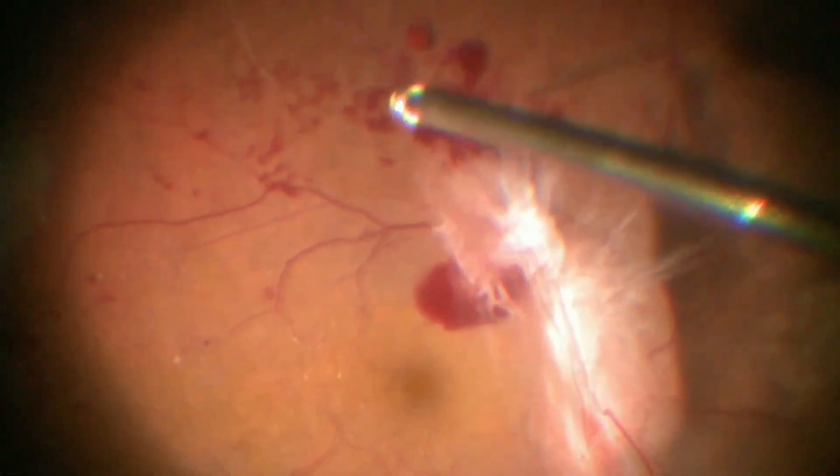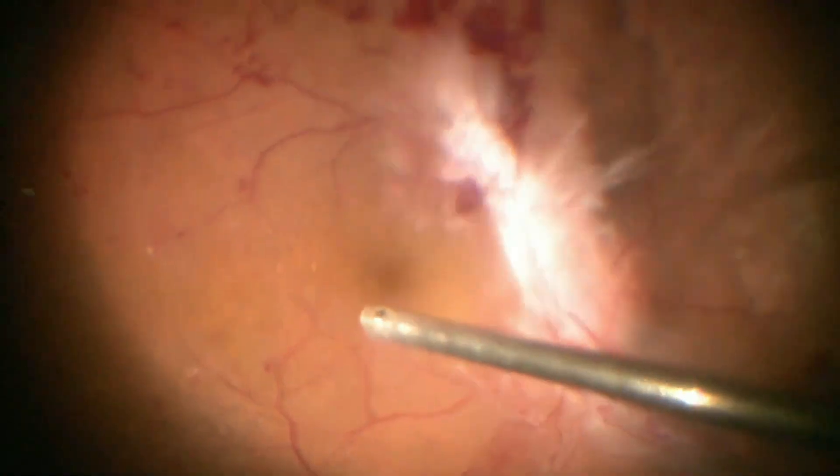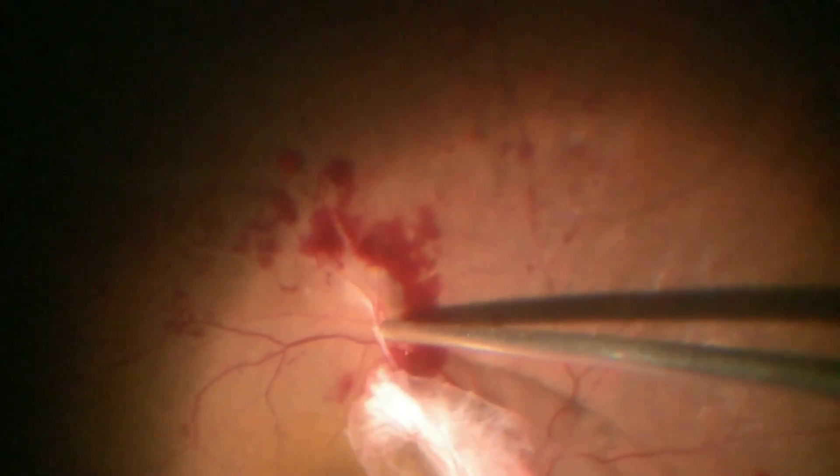This is a case of tractional retinal detachment with extensive neovascular proliferations. After doing core and peripheral vitrectomy, the cutter is used to carefully dissect the fibrovascular component which was present along the optic disc and arcades.